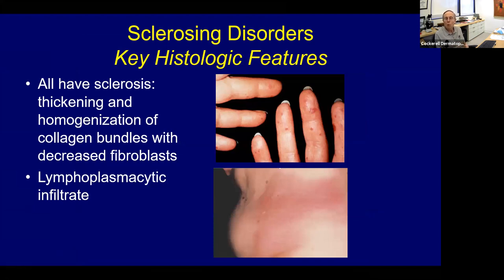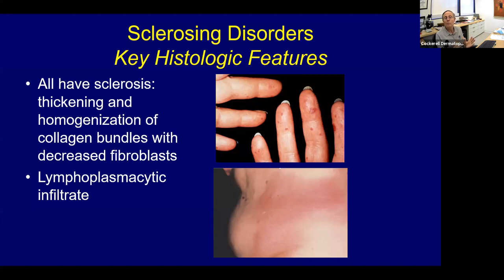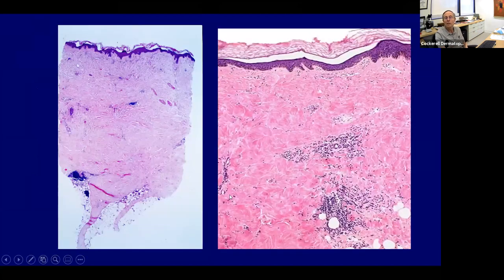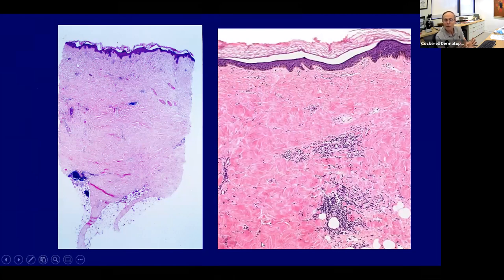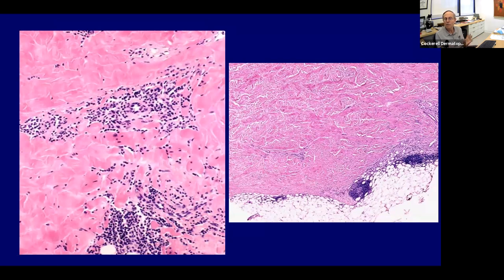Sclerosing disorders — morphea, scleroderma, CREST — strongly recommend learning about these. All have the classic reaction pattern of sclerosis of the collagen in the dermis and can look histologically the same, requiring clinical correlation. Sclerosis is thickening and homogenization of collagen bundles with a decrease in fibroblasts — distinct from fibrosis, which is an increase in fibroblasts. A beautiful example of morphea or scleroderma shows sclerotic homogenized collagen bundles, few fibroblasts, and lymphoplasmacytic aggregates.